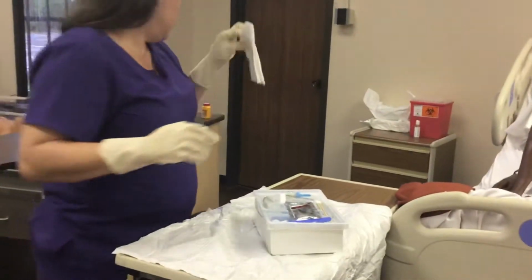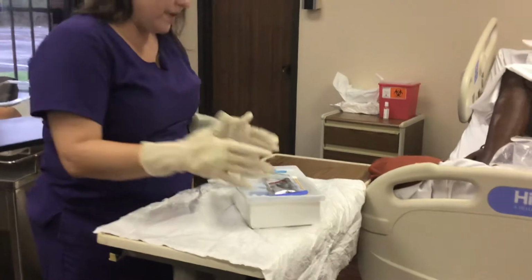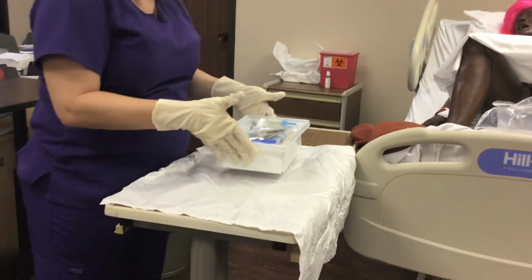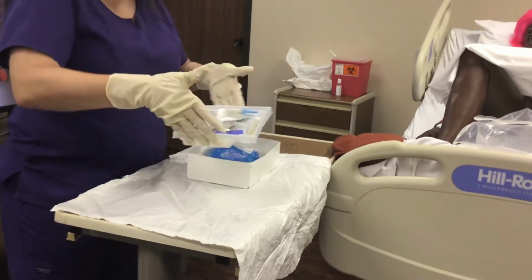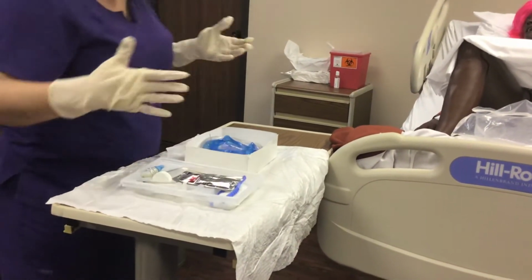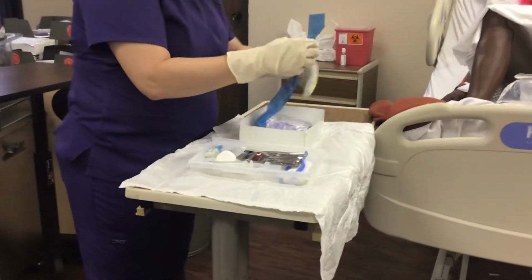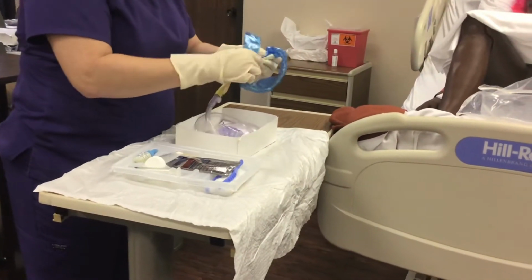This is for a male. Miss Shelton is not a male, so we're going to discard that. I'm going to take my box and turn it, also making sure that I'm still staying within the 1 inch margin. Okay. Go ahead and unwrap my catheter.